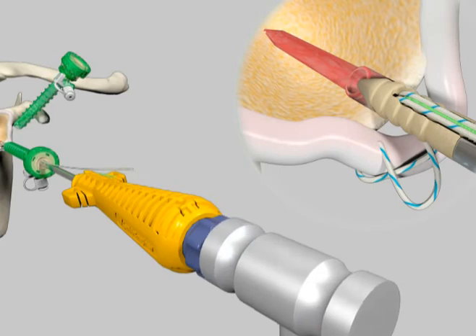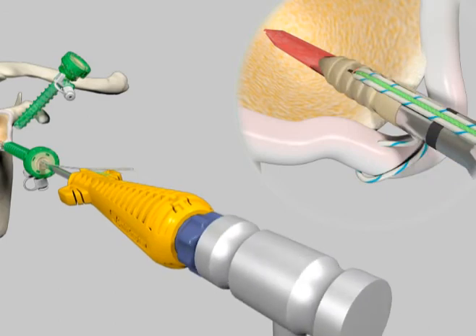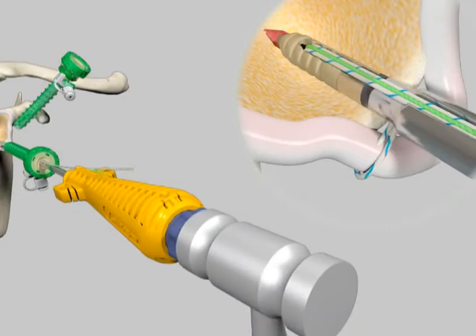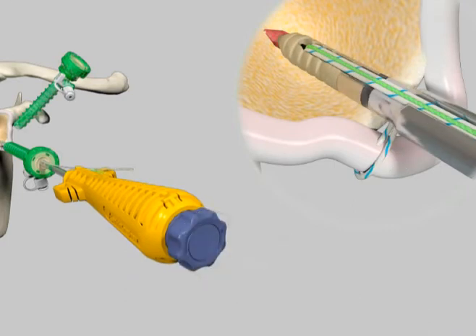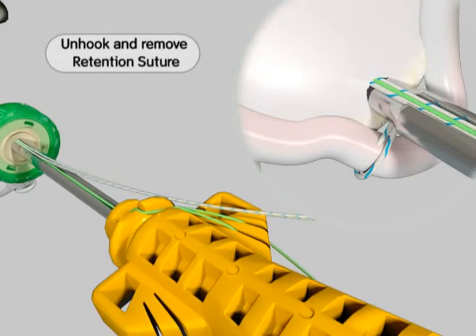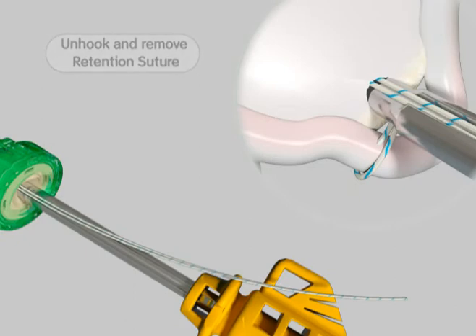Place the tip of the anchor into the prepared hole and tap the inserter handle with a mallet until the laser mark is flush with the cortical bone. This places the suture anchor approximately 2 to 3 millimeters below the bone surface. Unhook both ends of the retention suture from the inserter handle and pull one end to remove the suture from the handle. Discard the retention suture.